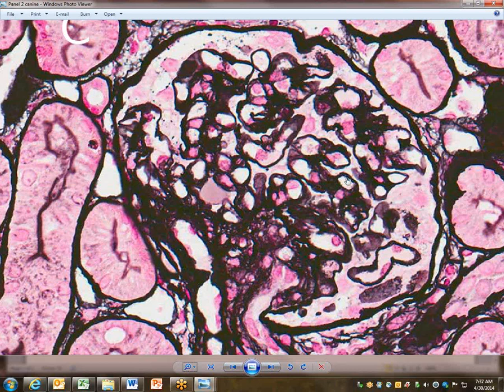That's not to say there's not synechia elsewhere in this specimen. You might be more concerned about this particular spot than out here, but you will want to see more evidence that it really matters than just because it's opposed.